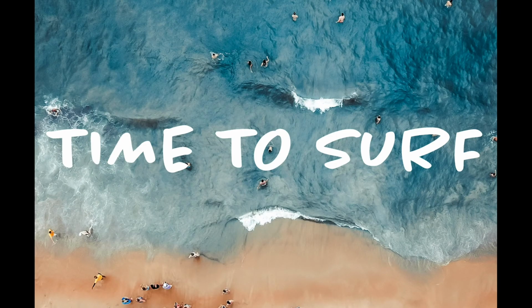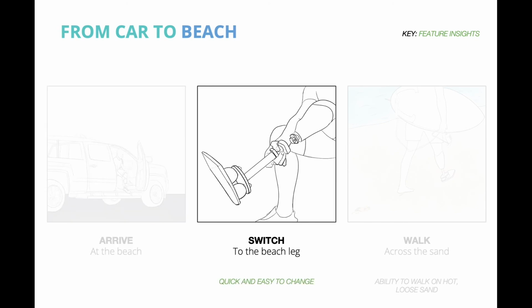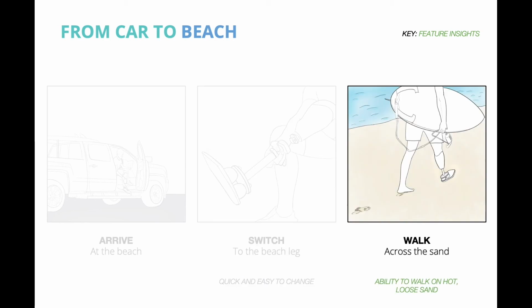Let's get ready to surf. First, arrive at the beach. Switch to your beach leg, then walk across the sand.